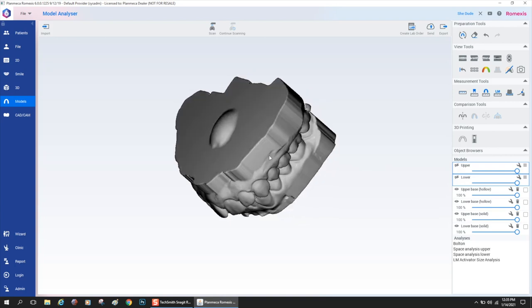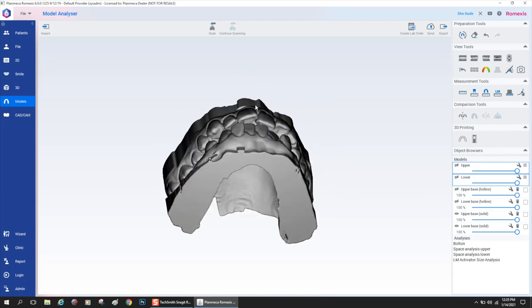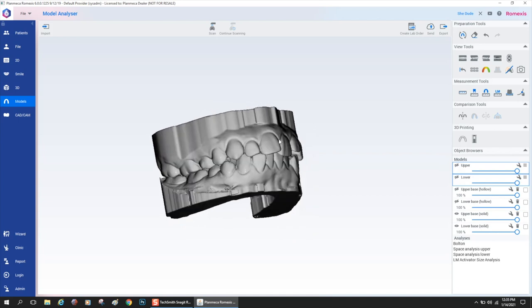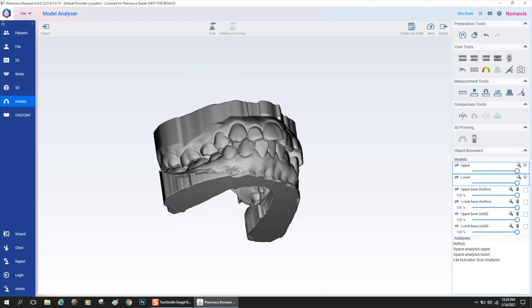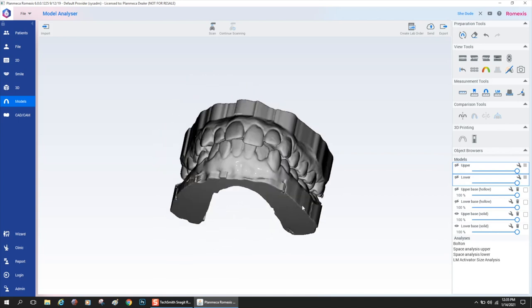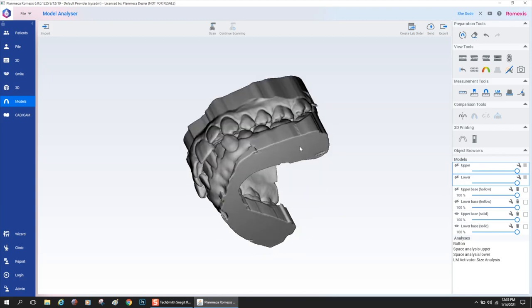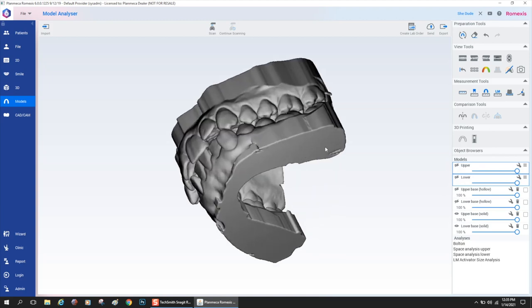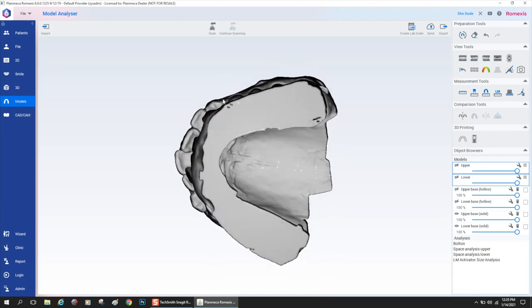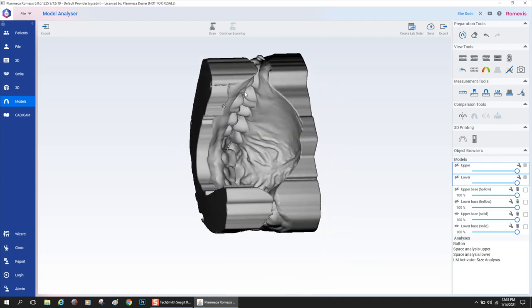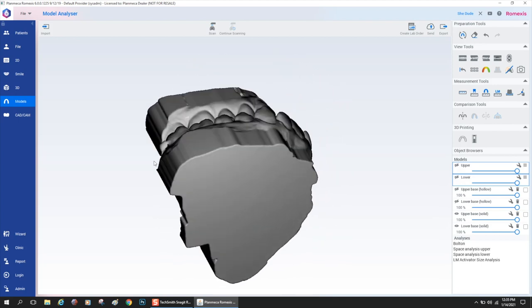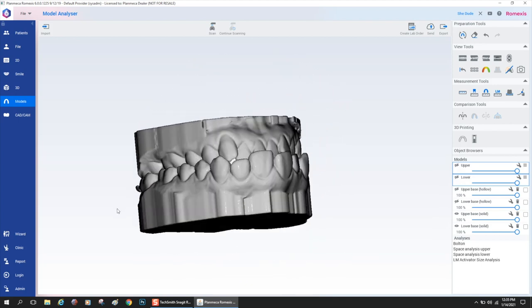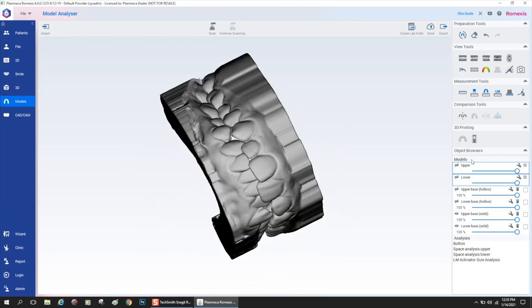So I always print solid. Here's the solid model ready for 3D printing. That is a flat plane that you can put on the build platform. So I always like to print solid. Those little hole areas are from where I didn't really clean up the edges of the model that well, but they will still print perfectly fine.